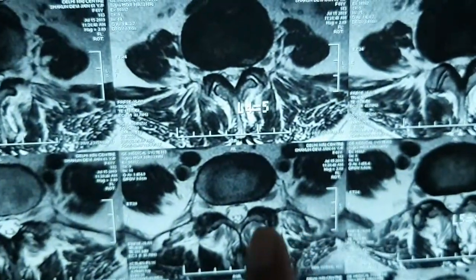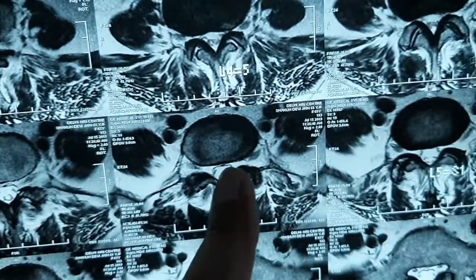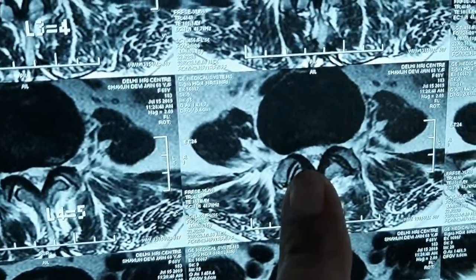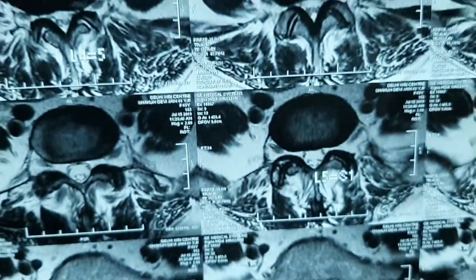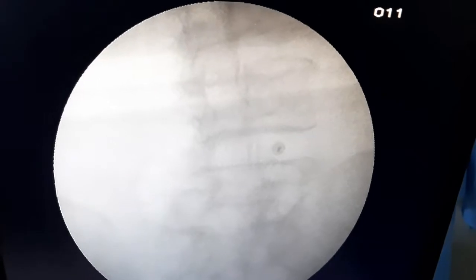If we look at the axial view, the disc and spinal cord are clear. But if we go to the right side, you will see that there is pressure on both sides. The MRI is completely clear. This is the L4-5 disc with right-side radiation.